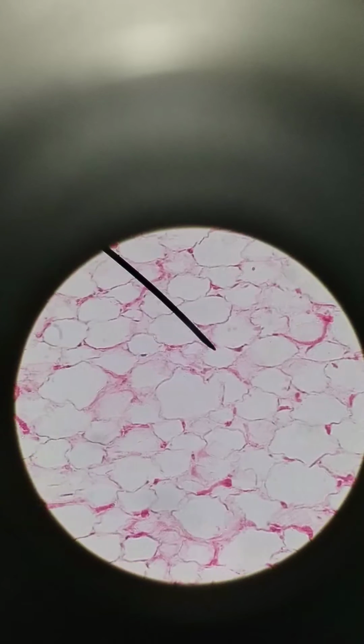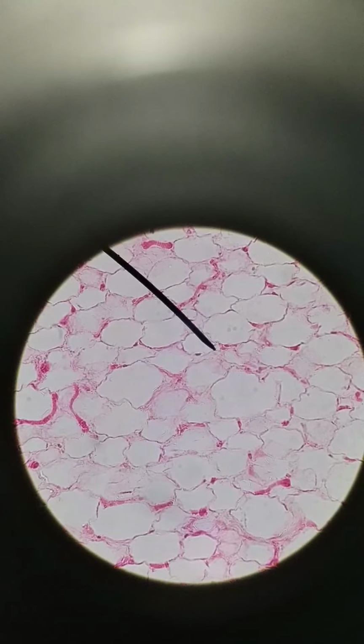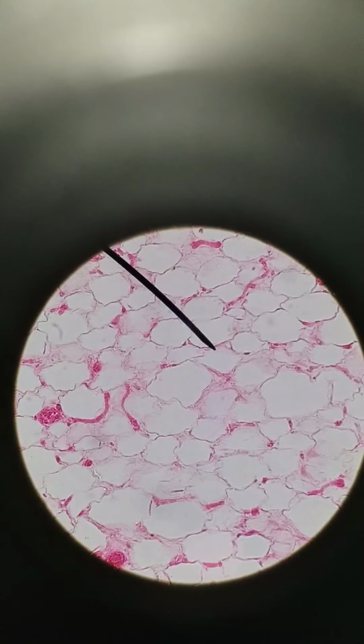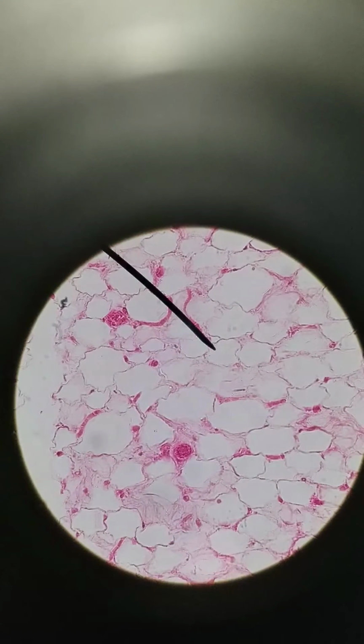They kind of look like simple squamous epithelium, like the ones in the lung, but you would see many more nuclei in the lung because epithelium demonstrates cellularity. There's a lot of packed cells together. And these cells are packed, but there are fewer of them relatively. There is collagen. You'll have to believe me that there is collagen in between these cells in the extracellular matrix.